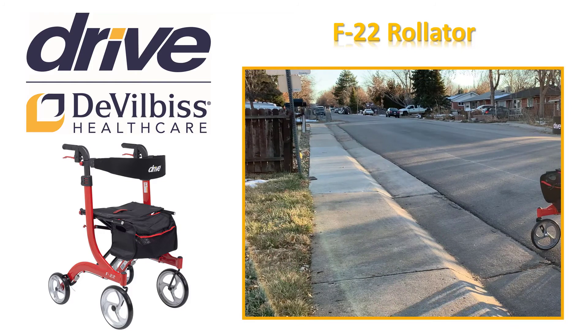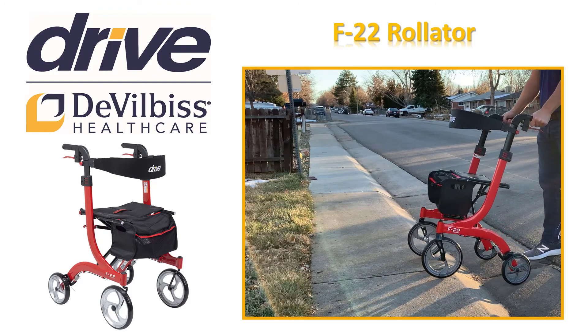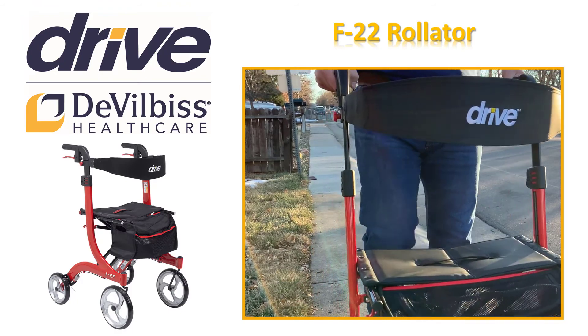Push the Rollator forward as the rear wheels approach the curb, step, or transition. Lift the rear wheels onto the curb, step, or transition. Proceed with walking once observing that all four wheels are safely past the curb, step, or transition.